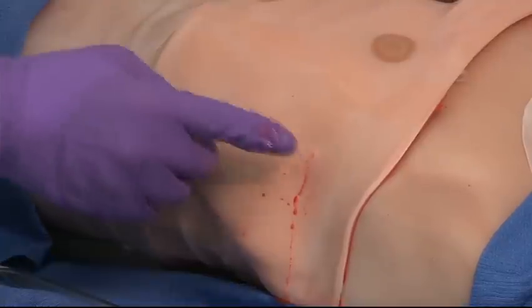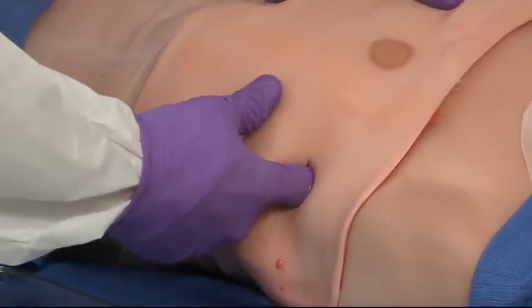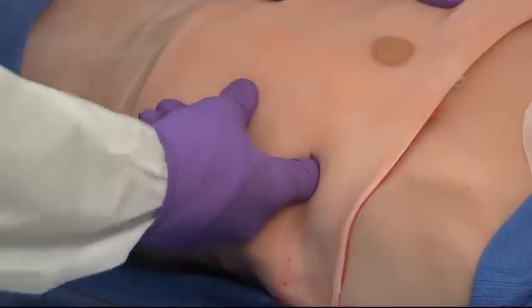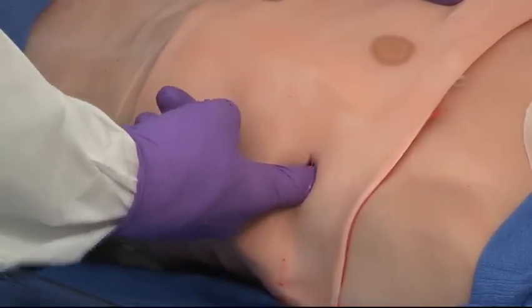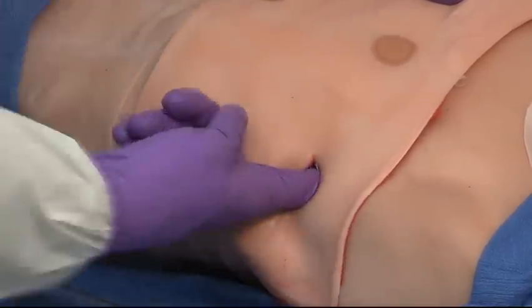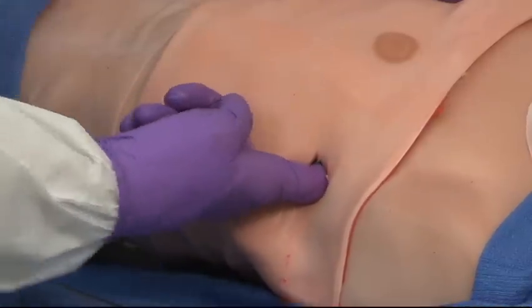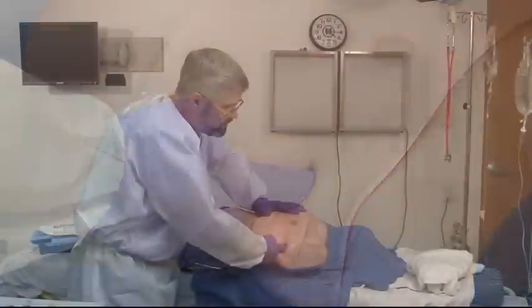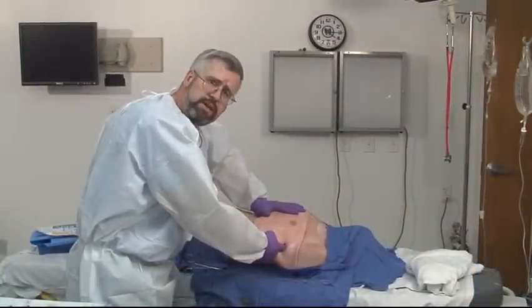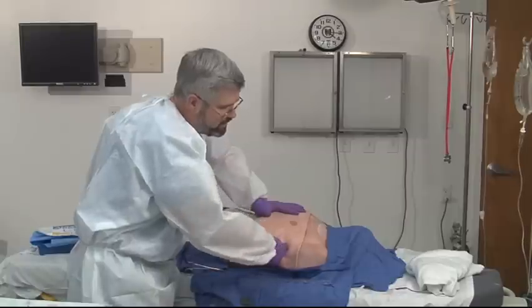The next step is to put my finger into the chest, confirm, number one, I'm in the chest. And in the patient, you should be able to feel the lung up against your finger. Also, the reason for putting your finger into the chest is to sweep your finger around inside the chest to make sure there's no lung adhesions with the lung stuck up against the chest. Because even if the patient has a pneumothorax, he can still have adhesions up against the chest wall, and you can cause additional damage to the lung if you don't sweep down these adhesions.